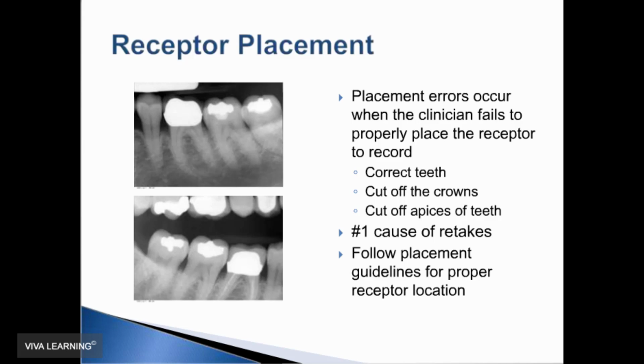On this bite wing, obviously the patient's not fully closed, and the receptor's not positioned such that equal portions of the maxilla and mandibular crowns are recorded.